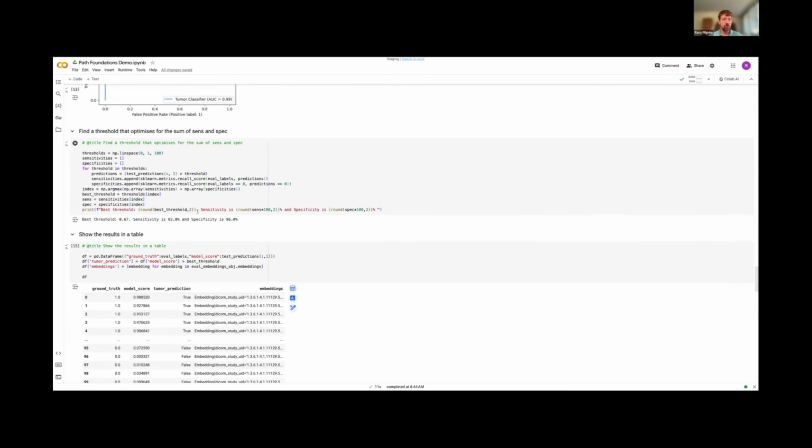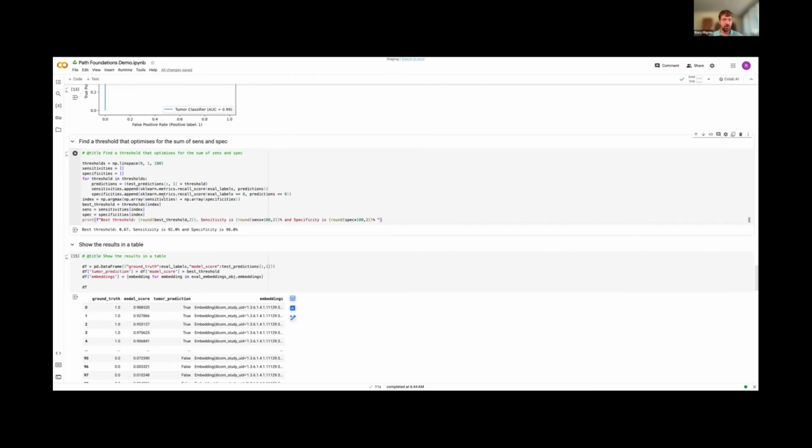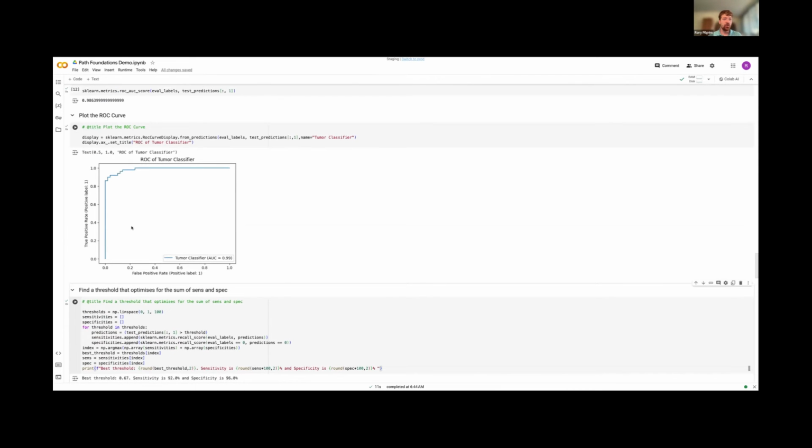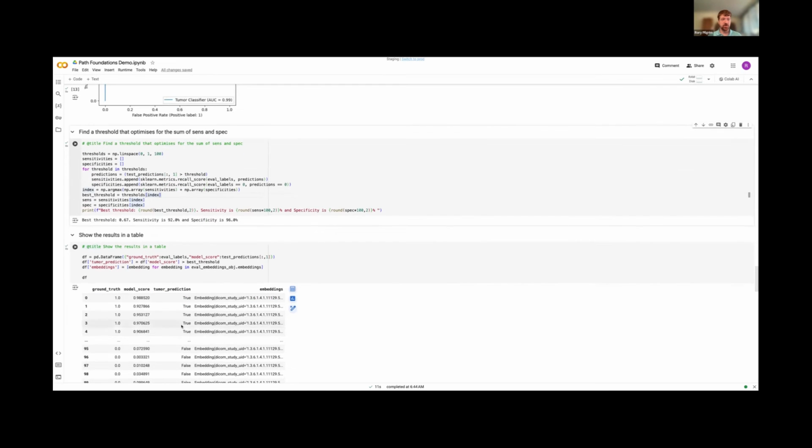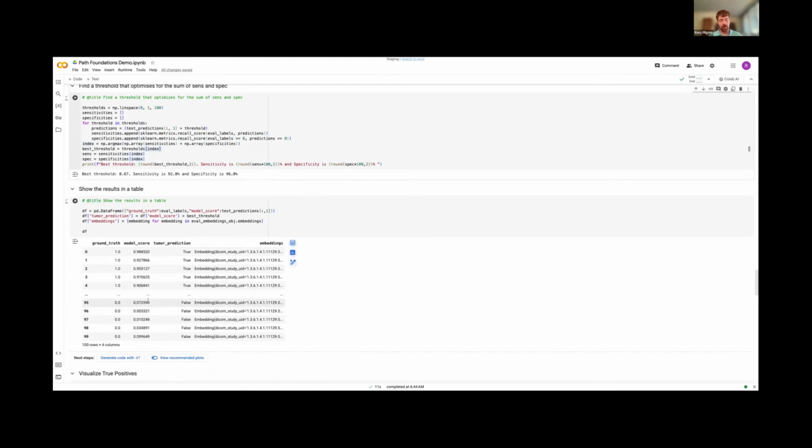Great question. So what we did here is a little bit of code where this is an AUC curve, and it's giving me 0.9, 0.99, 0.98 here. It's a very high performance on this set. Now, when you have these scores, as you'll see here, I have to find a threshold where I cut them and say anything above the score is a positive and anything below the score is a negative. And that's a decision I get to make as the model developer.